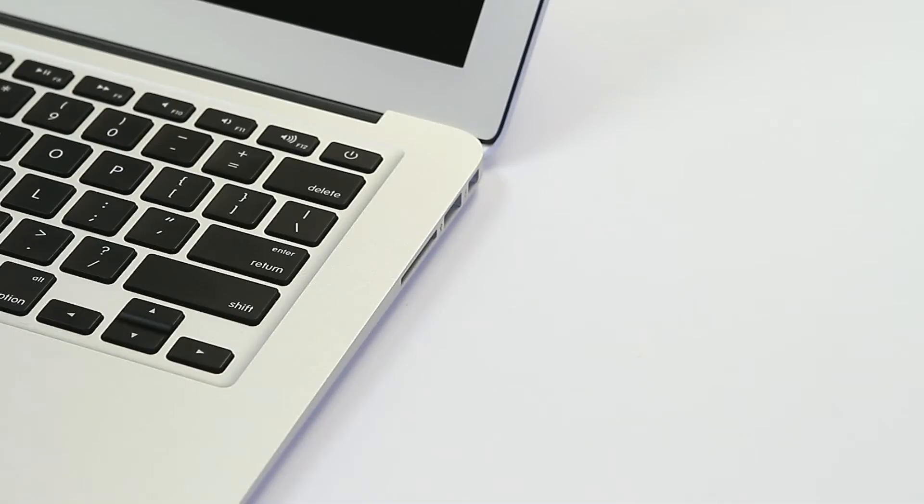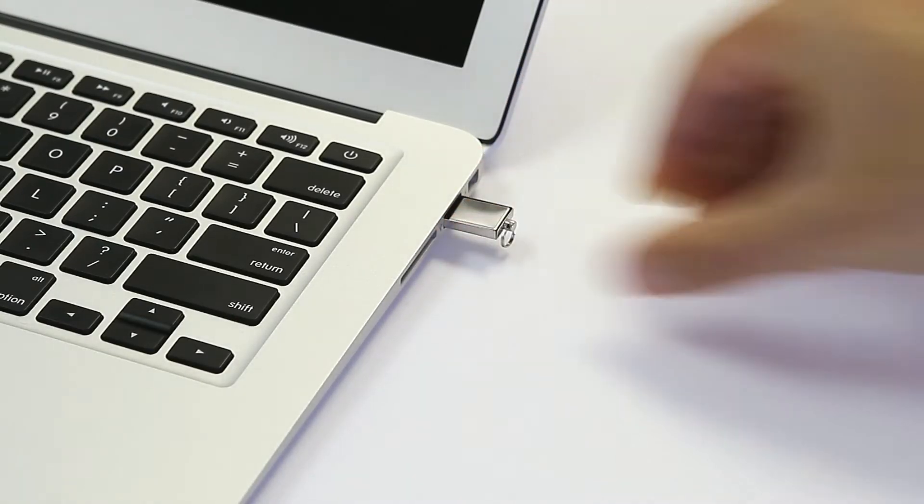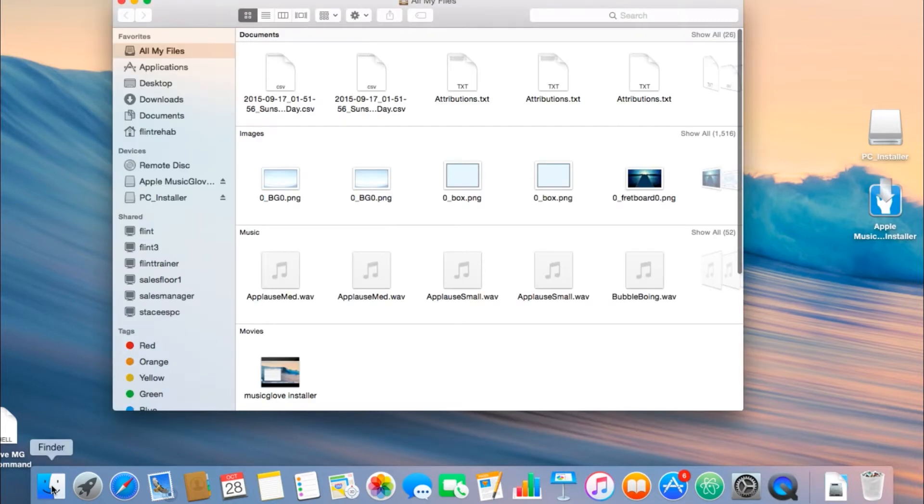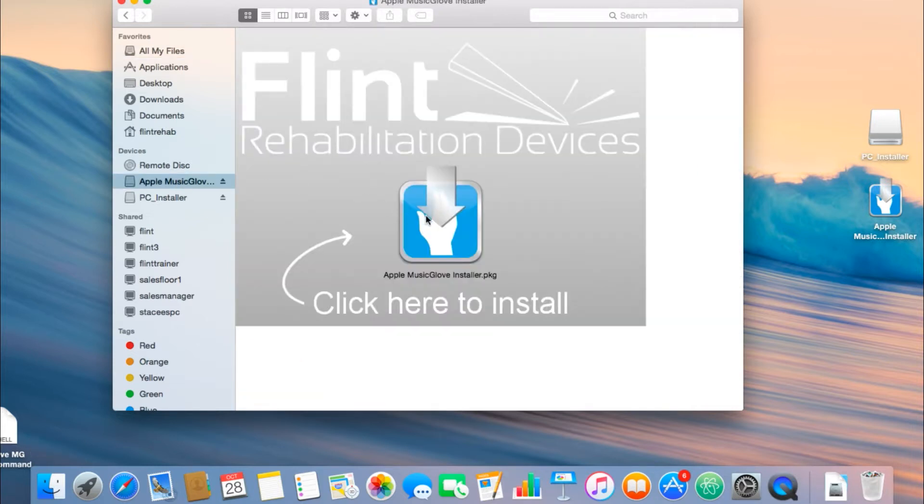Plug the flash drive into the USB receptacle on your Windows or Apple computer. If you're using an Apple computer, double-click on the Apple MusicGlove installer icon on your desktop. If you do not see an icon, click the Finder icon in the menu bar, then click on AppleMG installer under the device's heading.